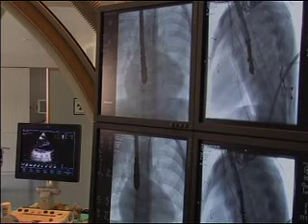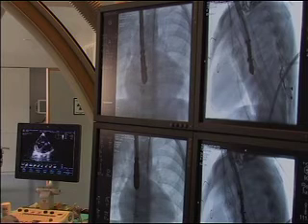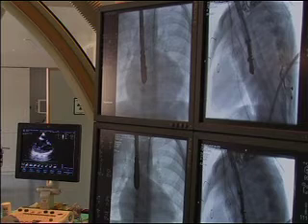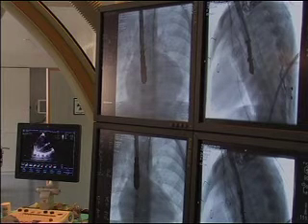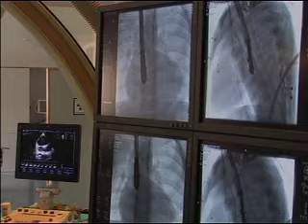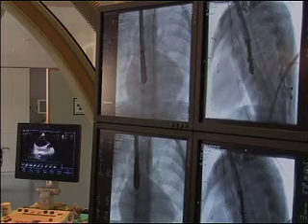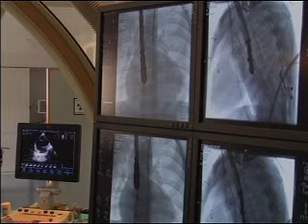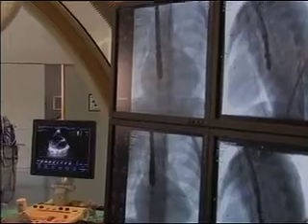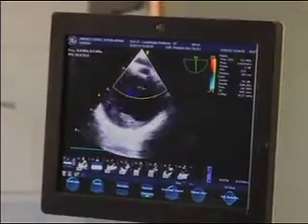Yeah, I mean, it's difficult to see the echo at the moment. Oh no, maybe this is the Eustachian valve. Can we see it more precisely? Because it's not related to the catheter. The catheter is far away. So this is the Eustachian valve. Okay. I will go once again with the needle, looking for a better place.